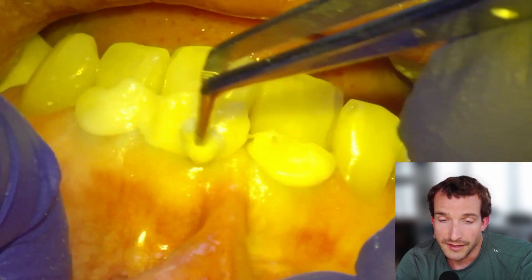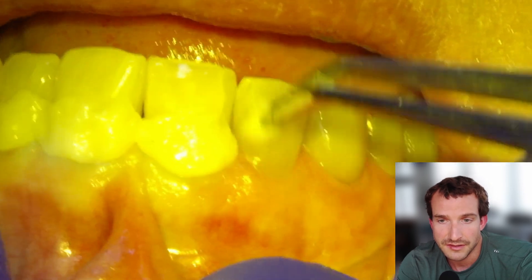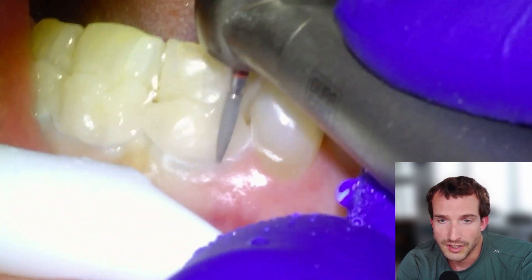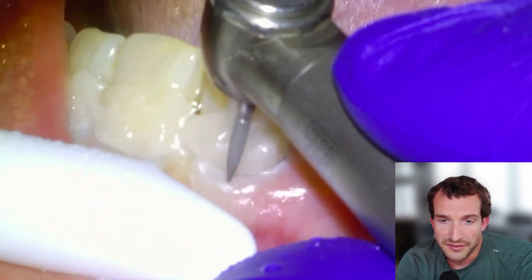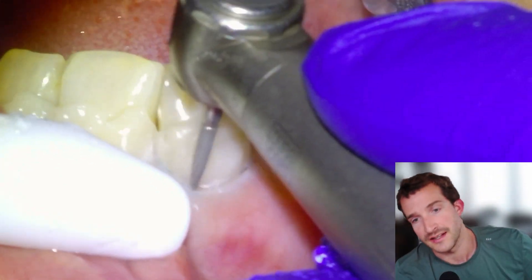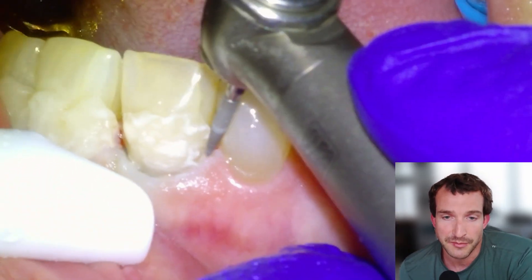The thing about using this material compared to composite is that it's much easier to overfill and then trim back, as opposed to shaping to the exact dimensions of the final restoration. We'll adapt it, light cure it, and then right away get into trimming using a fine diamond. It is a softer material so it trims back quite easily. It doesn't need to be very hard because it's not in occlusion, and it's much stickier than composite.